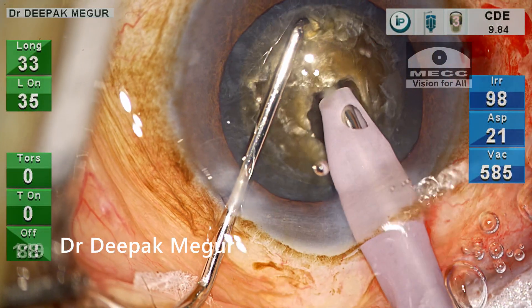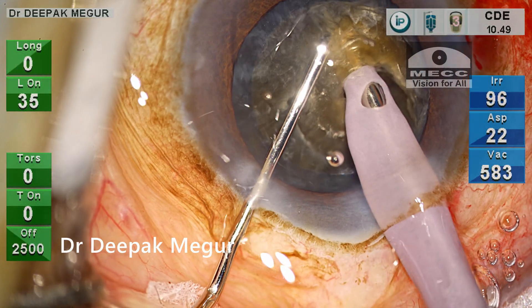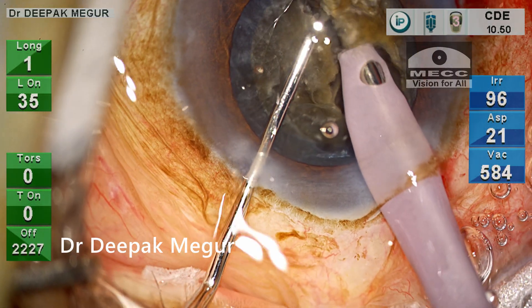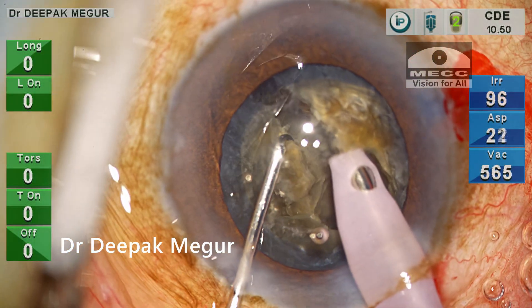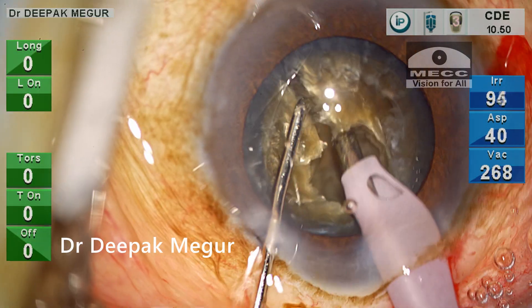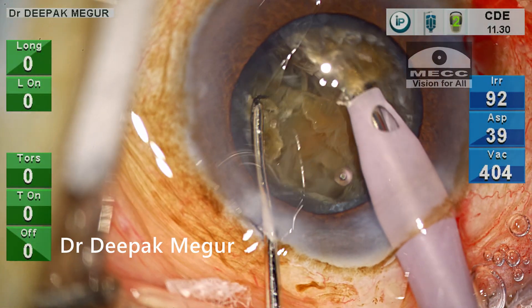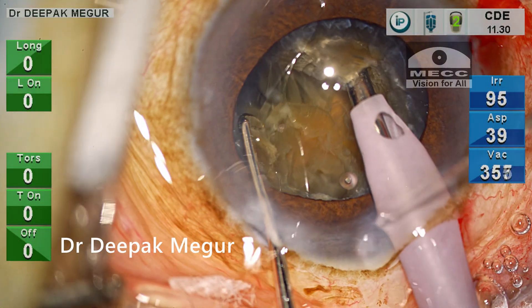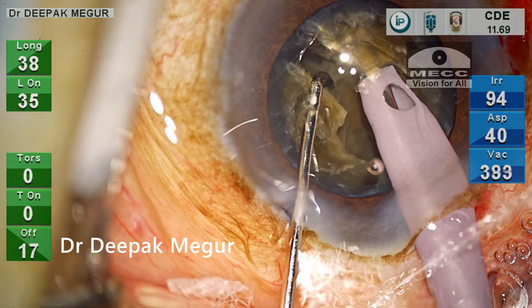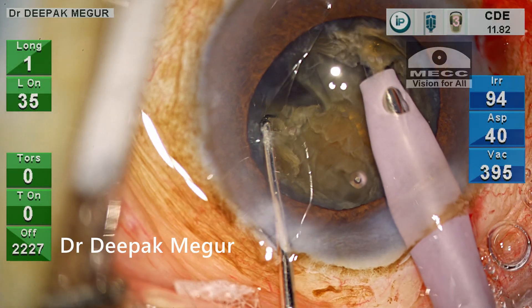I'm burying the tip deep into the nucleus and creating my first crack using a vertical chop technique. The crack is initiated, but I'm unable to achieve a through-and-through first crack, so I re-bury the phaco tip and try to laterally separate. The posterior plate is still not completely separated — I am unable to place my second instrument deep enough, which is preventing the posterior plate from cracking.